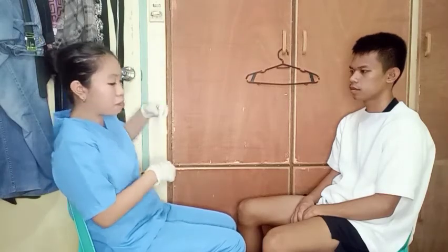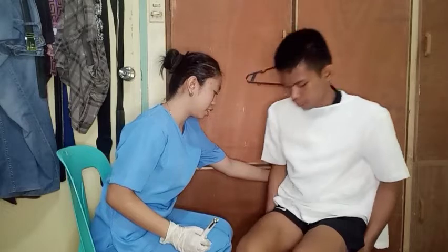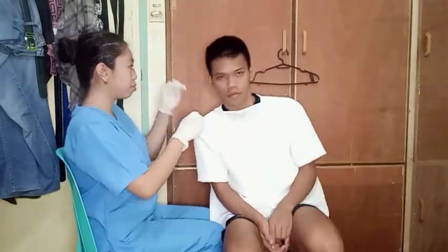First is to inspect the external auditory canal with the otoscope for the discharge, color and consistency of the cerumen, color and consistency of the canal walls, and nodules. Since we do not have an otoscope, sir, I will be using a pen light to check your external auditory canal. We will see if there is any discharge from the area, and check the color and consistency of the cerumen, the canal walls and the nodules. Sir, kindly turn your head. Okay, sir, thank you.